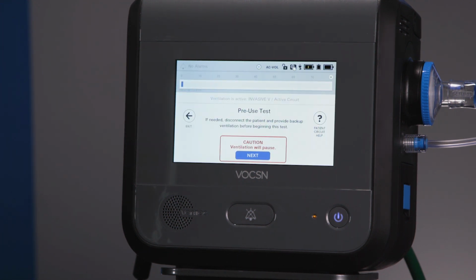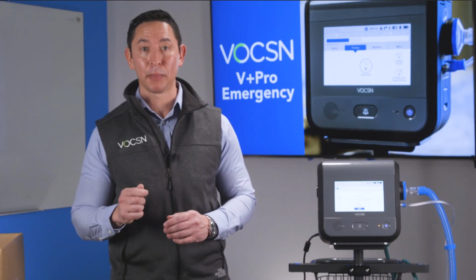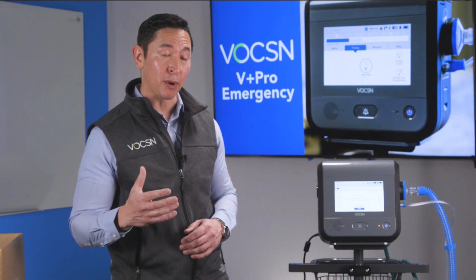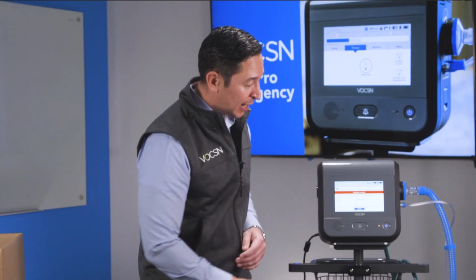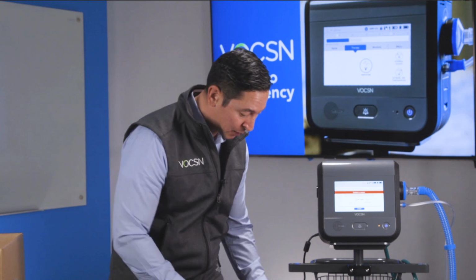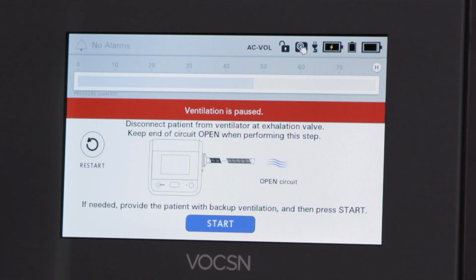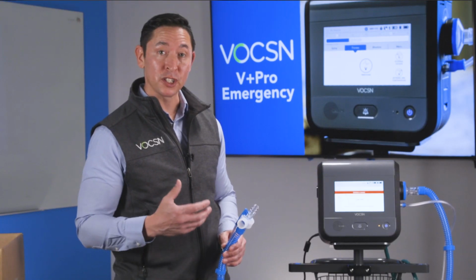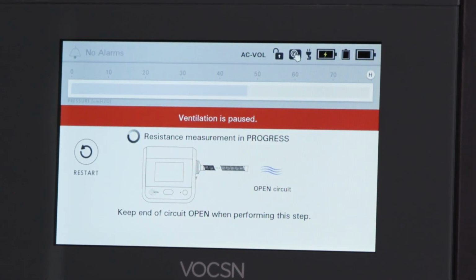The first screen that you're going to be brought up to is going to ask you to do a pre-use test. Now, if you're in an emergent situation and you need to immediately ventilate a patient, you could simply exit out. But I'm going to show you how to actually do a pre-use test right now. So I'm going to follow the instructions on the screen. I'm going to touch next, and it's telling me to disconnect the patient circuit. So I'm going to disconnect from that test lung, and I'm just going to hit start and leave the end of the circuit open. This first portion is just measuring the resistance.